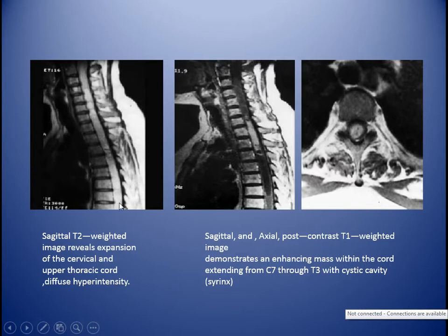The sagittal T2-weighted image reveals an expansion of the cord of the cervical and upper thoracic with diffuse hyperintensity. Sagittal and axial post-contrast T1-weighted image demonstrates an enhancing mass within the cord, extending from C7 to T3, with cystic cavity.